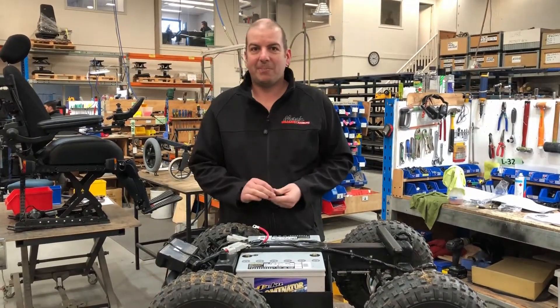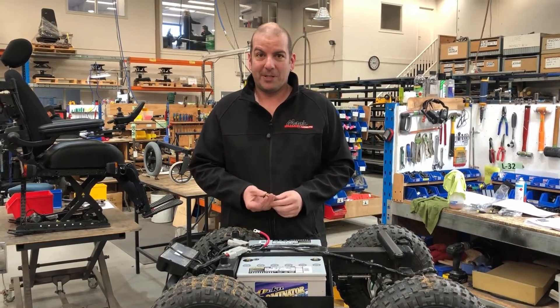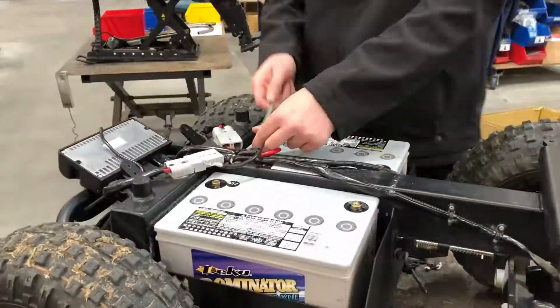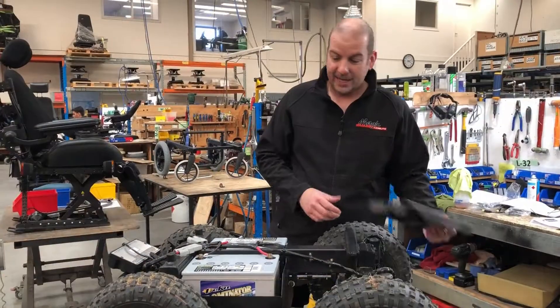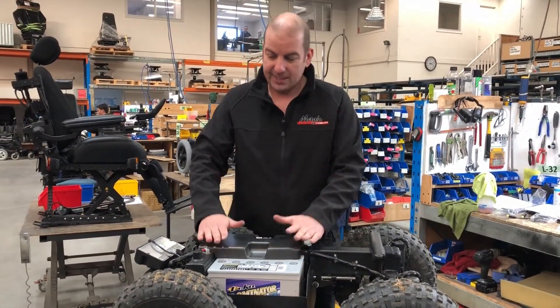Now that we've got our batteries back in, we just need to put the terminals back on in reverse order, making sure we do the positive first and the negative last. Then we refit our battery cover and that's it — we'll put the seat back on and reassemble in reverse order.